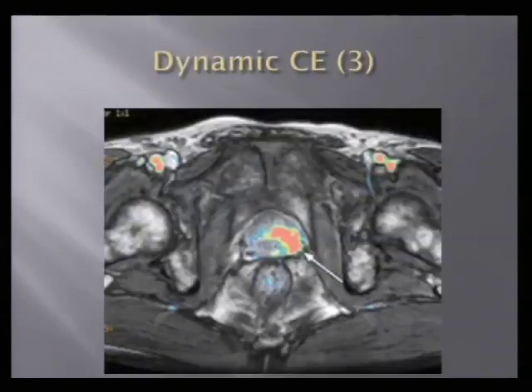neovascularity. And here's some examples of dynamic contrast enhanced imaging where you use color maps. So basically what happens is you do about 15-second image acquisitions of the prostate right after you give contrast. And red is to denote areas that have rapid washout because it's really, really difficult to evaluate things like this looking at the myriad of, and I'm sure the urologists and radiation oncologists that have seen our studies have seen, we probably have, I don't know, maybe 40 post-contrast sequences that we really are doing to try to get this, and you need certain software to be able to show these color maps.